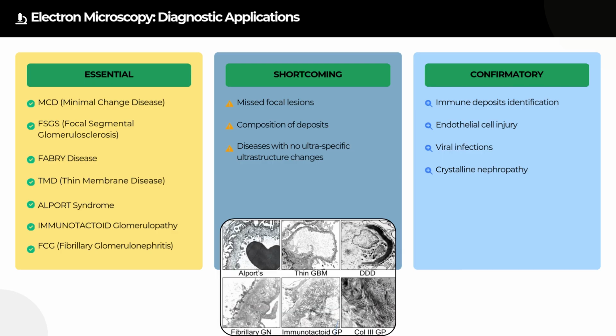However, EM has some limitations. It can miss focal lesions, and it also cannot reveal the exact nature of any deposits. It's also not useful in diseases that lack specific ultrastructural changes.